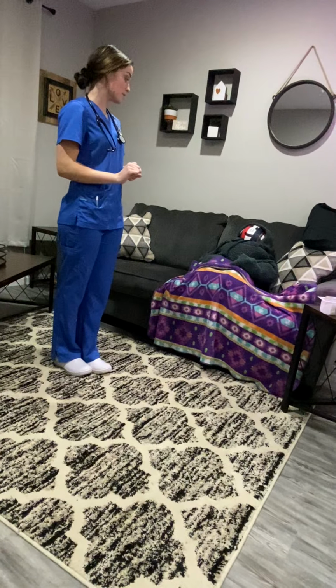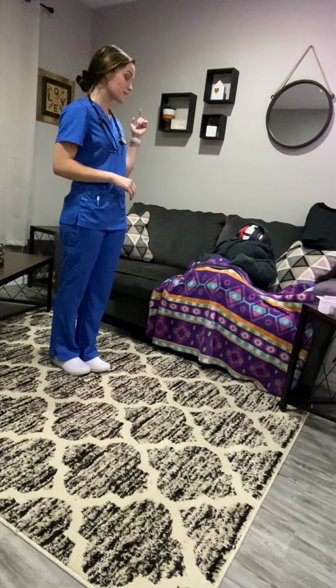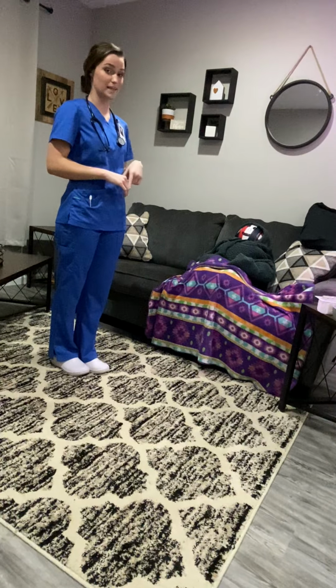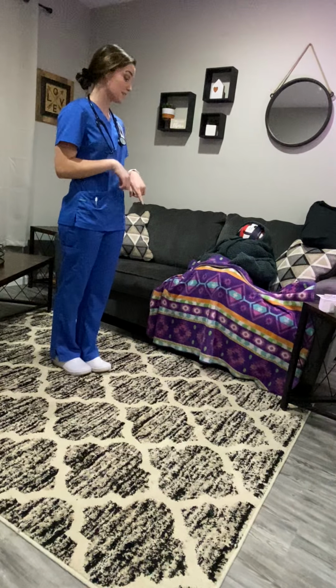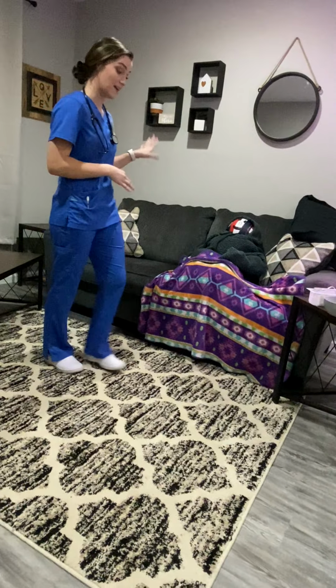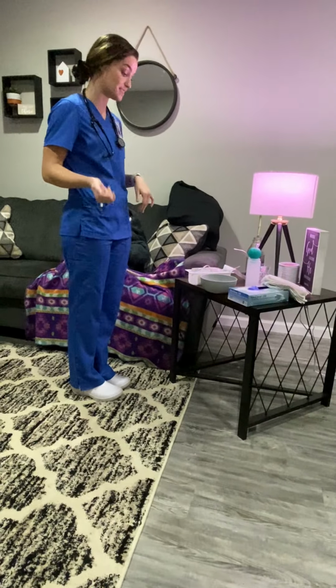So I'm going to first have the patient close each naris to assess the patency of the nares. So she's going to do that on one side and then do that on the other. I have my supplies here. I'm going to perform my hand hygiene and get all this ready and set up.